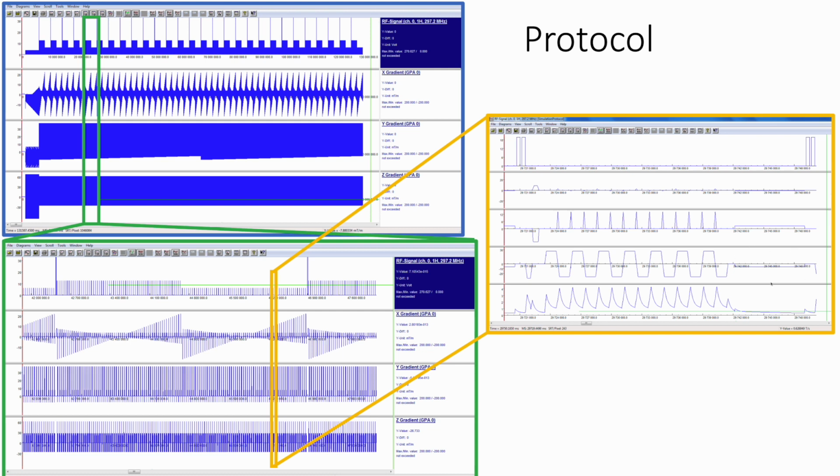So we are basically wasting 20% of the time to get the peripheral nerve stimulation, which is modeled down there, and down to a low level so we can start again. Because ultimately we are limited with peripheral nerve stimulation at the shoulders. We're not limited by the gradient performance.